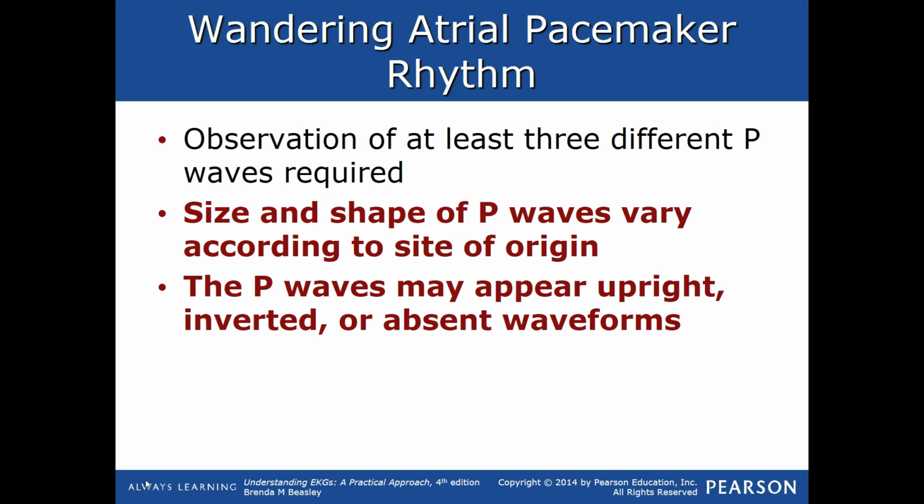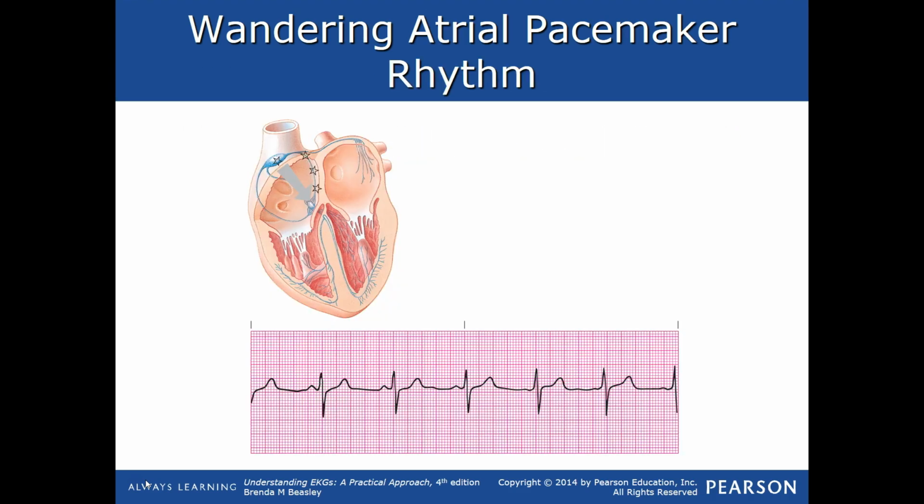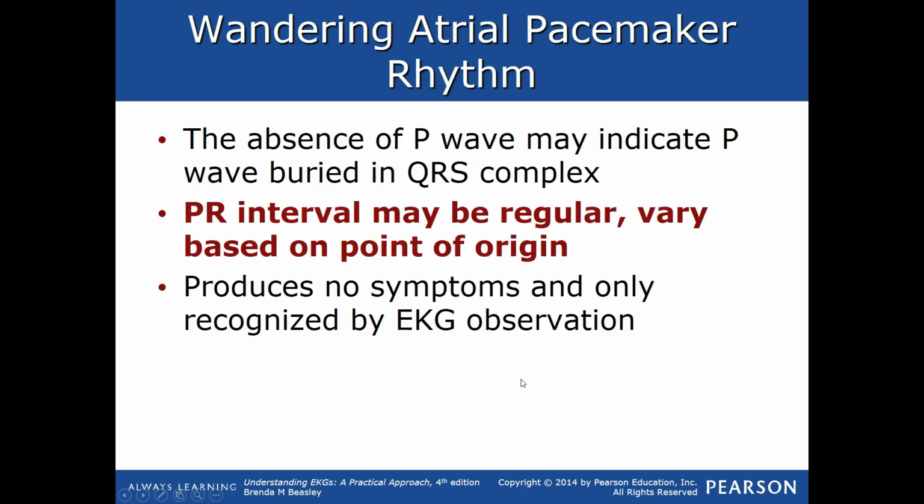So what we mean by that is you're going to see guys like this. You see a difference here as opposed to here, as opposed to here. These things are either moving, or their PR interval is changing. You can see that here. This guy's PR interval has changed from here to here. You can see the morphology, or the shape, of it has changed as well. Everything has changed about it.